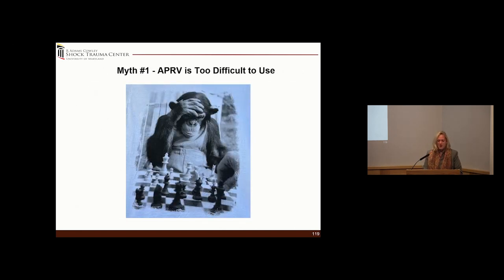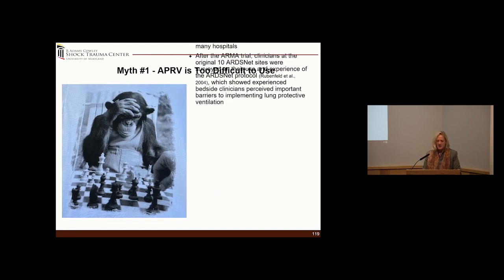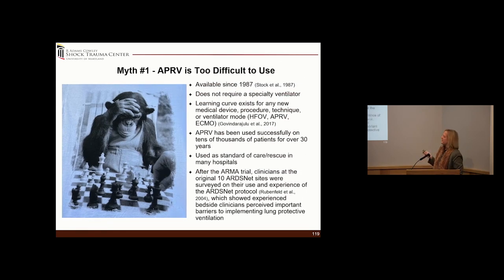So myth number 1, APRV is too difficult to use. These are all things that we have read that have been published in papers, and if you read the myths and misconceptions paper, you'll see where they're cited, where some of the claims have been made. But the interesting thing is that it's been available since '87. It doesn't require a special ventilator, not like if you go on to high frequency, where you have to have a special designated ventilator. It's simply another mode, another option here.